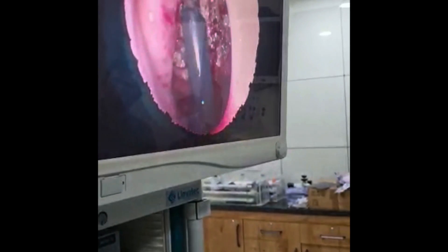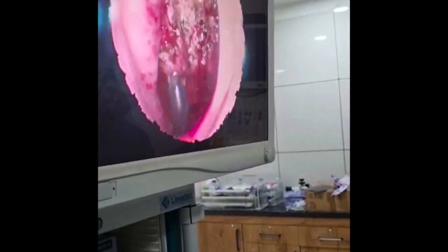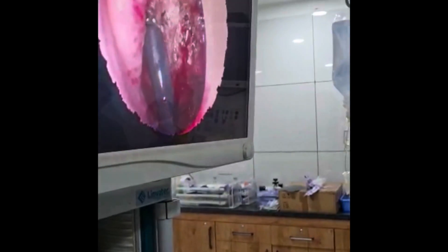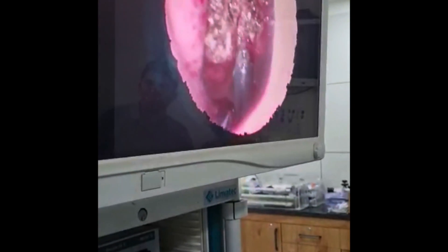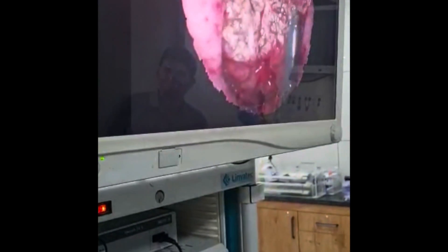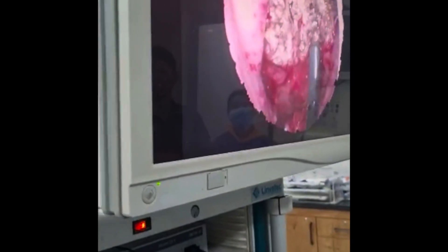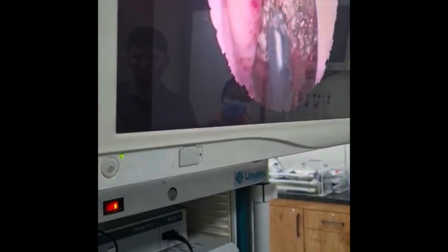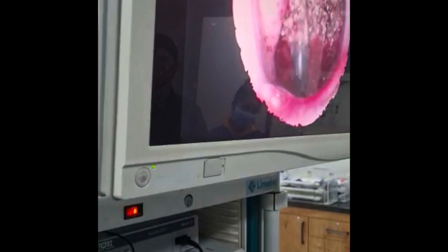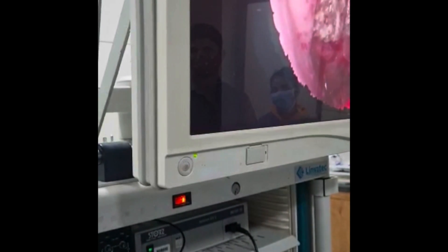I am using coblation. You can see there is only mucosa left — the rest of the adenoid has been resected. Complete adenoid resection is possible by this transnasal adenoid wand coblation method. We will see and resect as required. In patients up to 25 years of age, because of food habits and allergies, the adenoid may persist — normally it disappears after 14 years of age. Complete adenoid resection is compulsory; there is no recurrence.